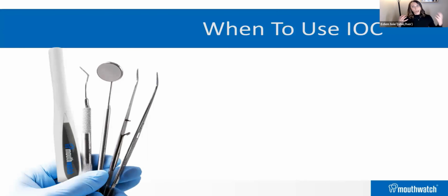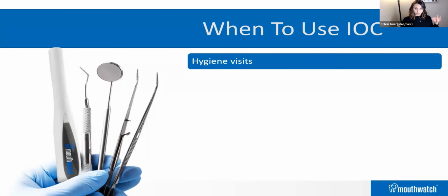Now, we know we need an intraoral camera. We know what to look for in an intraoral camera. So when should we be using this intraoral camera? Hygiene visits. I like to use them at every hygiene visit. We want to use these cameras for OHI and for progress pictures, and really anything that's flagged for the dentist to review.